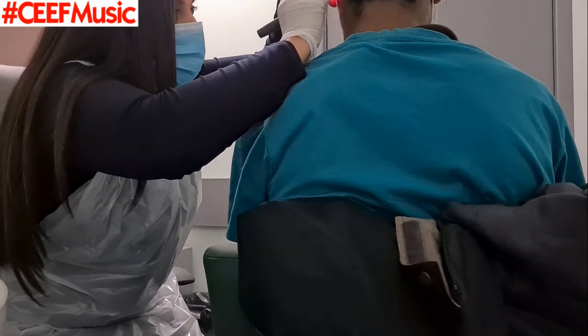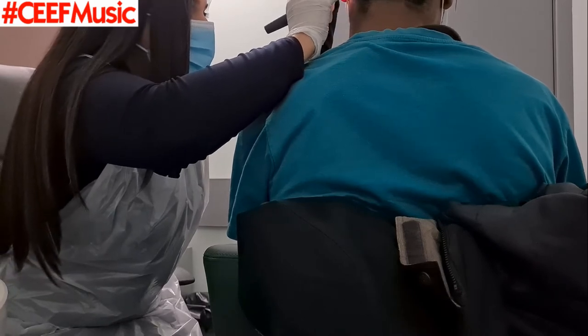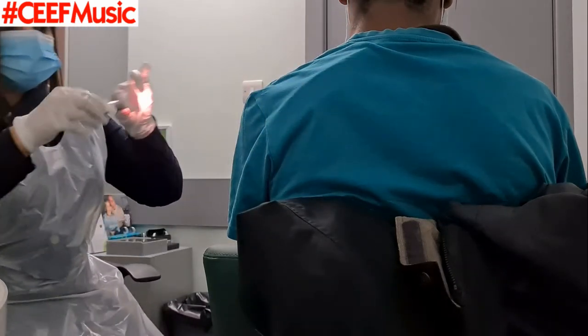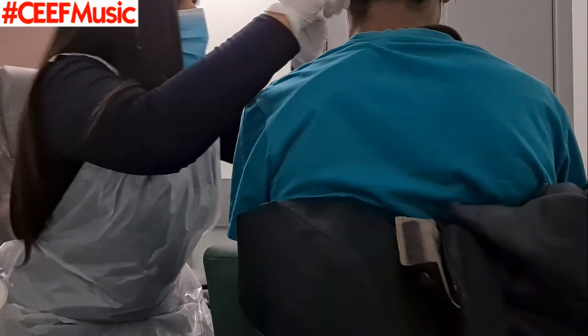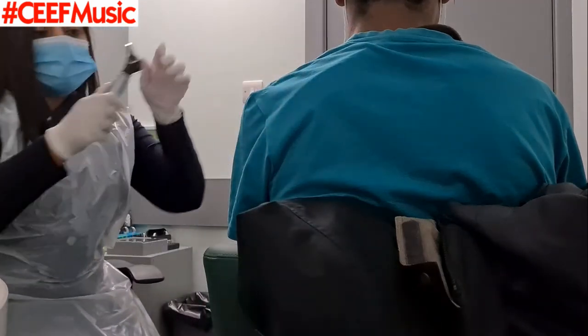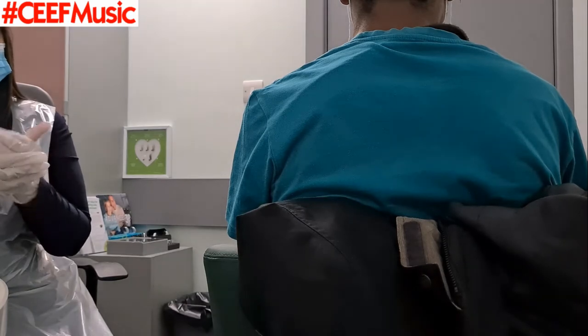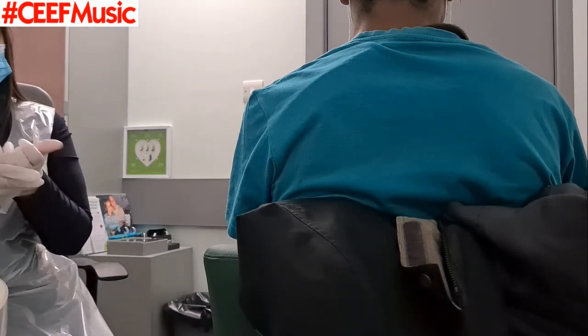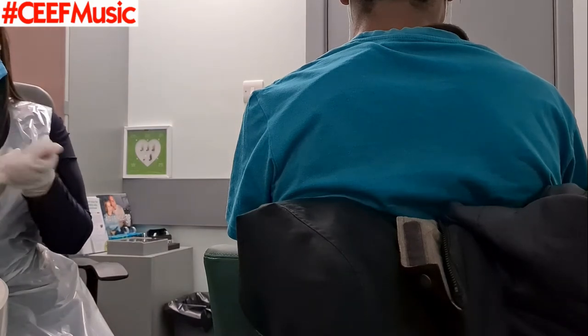Shout out to Specsavers, honestly, like they're brilliant. If you want to get your impressions done, literally call them up and explain your reasons — they do a great job. Getting those checks done, gotta be safe. And at this point, I can't lie, I didn't know what to feel. I was just closing my eyes at points, opening my eyes. Once again, we got the mixing of the two substances.